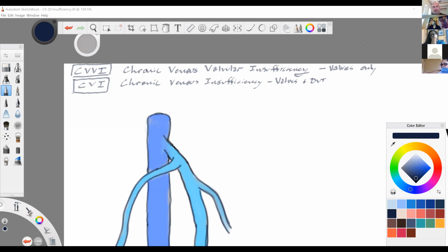The problem with insufficiency testing is that you are mapping in detail while you're insufficiency testing, while you're drawing on the leg with gel everywhere, and the patient should be standing and they're old and the leg is shaking, and you can't do anything when the leg is shaking. But I also know people who are good at this exam and they love doing it. Well, it's also a very long exam to do both legs. A full study, both legs, is, even for a practiced person, an hour and a half. That's a long time to be with a patient. Hopefully they're patient along with you.